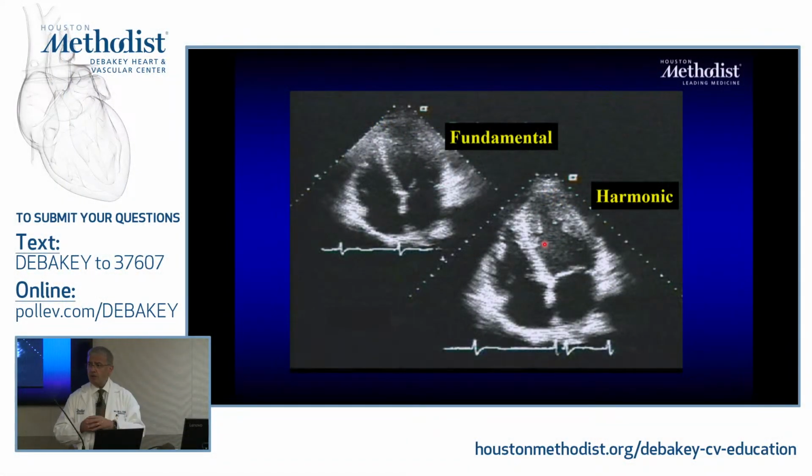Okay? So, although not as important, you need to know that the resolution of the structure you're looking at is at 2.5, not at 5. Why? Because therefore my resolution is a little lower. So that's why the mitral valve may look a little thicker than usual, et cetera.